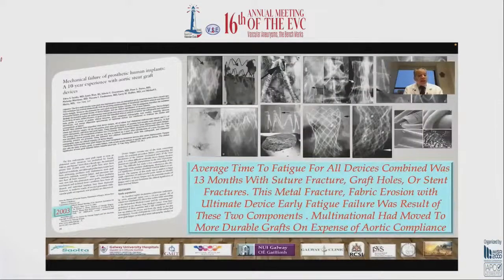You remember in 2003, this paper from the Michael Marin group in New York talked about the mechanical failure of prosthetic human implants. They represented to the FDA and showed that the average time to fatigue for all devices combined was 13 months, with suture fracture, graft holes, or stent fractures. This metal fracture and fabric erosion, with ultimate early device fatigue failure, was the result of these two components.